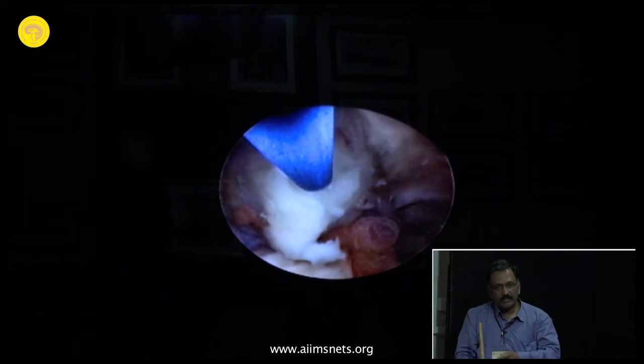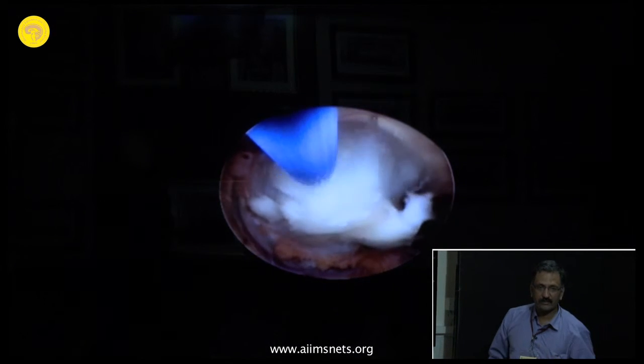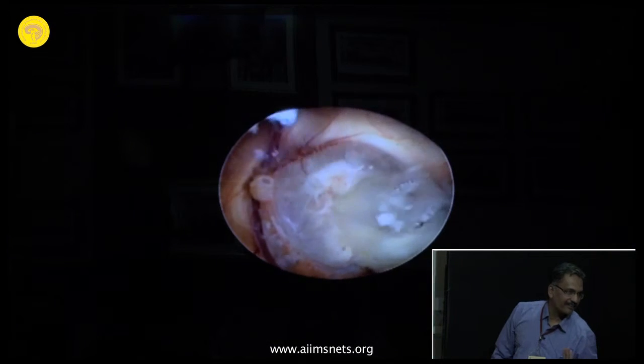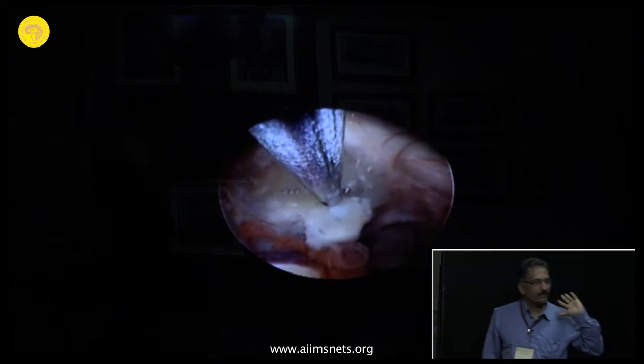After you have decompressed the entire colloid cyst, if the hydrocephalus persists, you can always go in and do a shunt, right? The colloid cyst is over, you just do a simple shunt and come out. But if you try to remove the capsule, this is going to be a disaster.